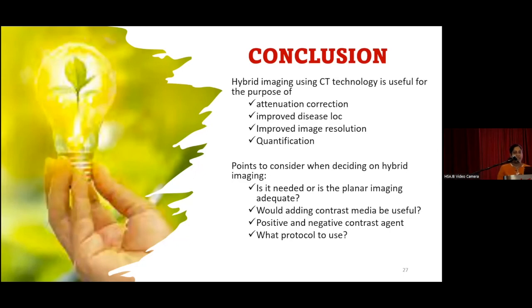The planar imaging is definitely not going to go away fully. And would adding contrast media be useful? And whether we want to use positive or negative contrast agent, and what protocol to use. With that, I would like to thank you.